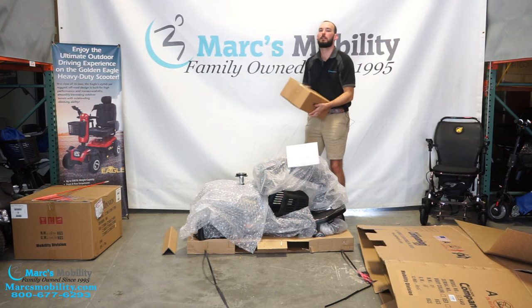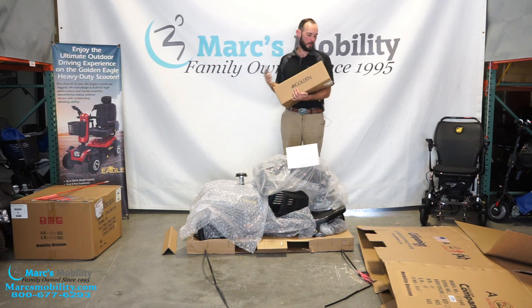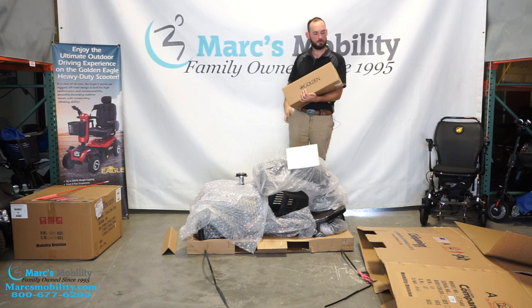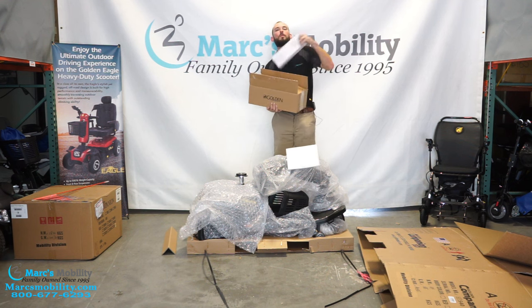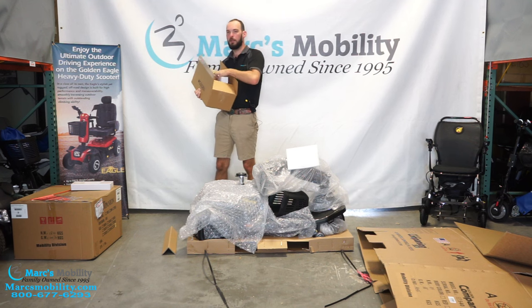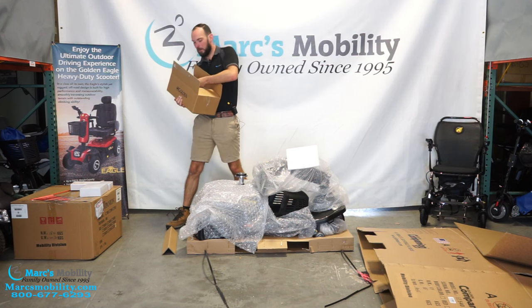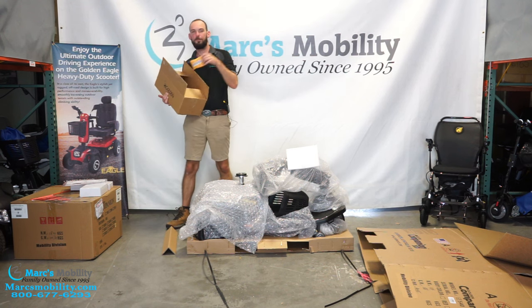We have this other box in here. This is most likely going to be our charger and owner's manual. So I'm going to go ahead and open this up. We have our mirror, here's our battery charger, we have our owner's manual, and finally we have our keys.